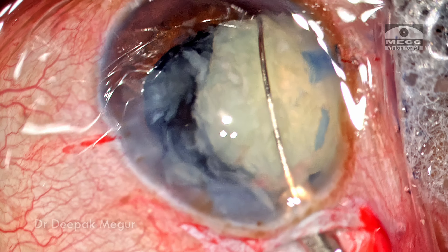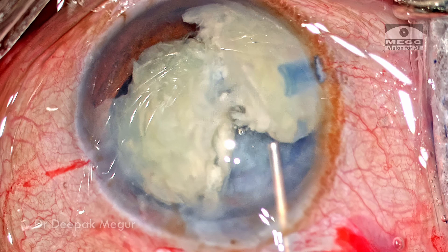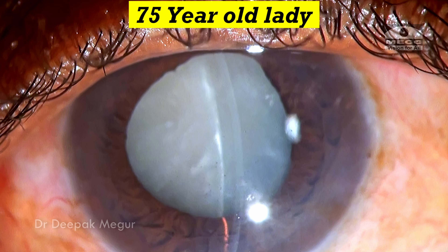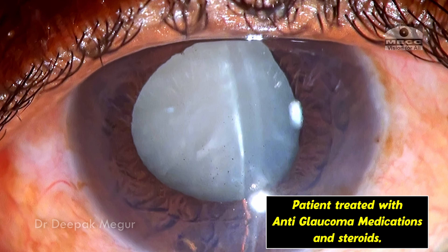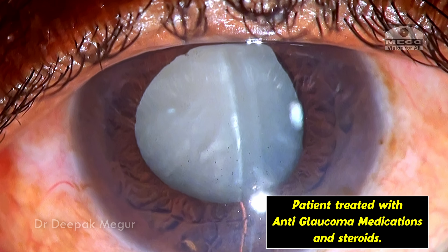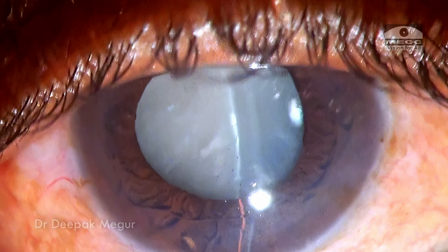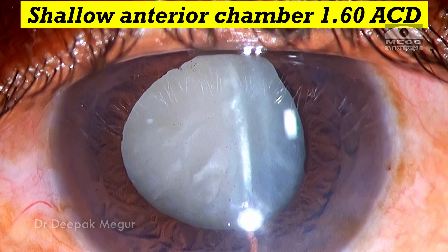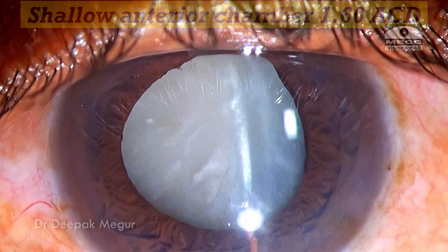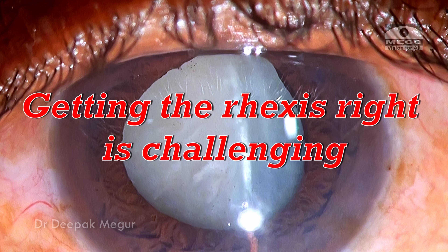In this case I'll be demonstrating the use of a snare to bisect the nucleus in the anterior chamber. This is a 75-year-old lady who has presented with phacomorphic glaucoma. With anti-glaucoma medications and topical steroids, the pressure and inflammation have been kept under control and she's now scheduled for surgery. On slit lamp examination, the anterior chamber depth is quite shallow at around 2 millimeters, and the lens is very swollen — getting the rhexis right is going to be a challenge.